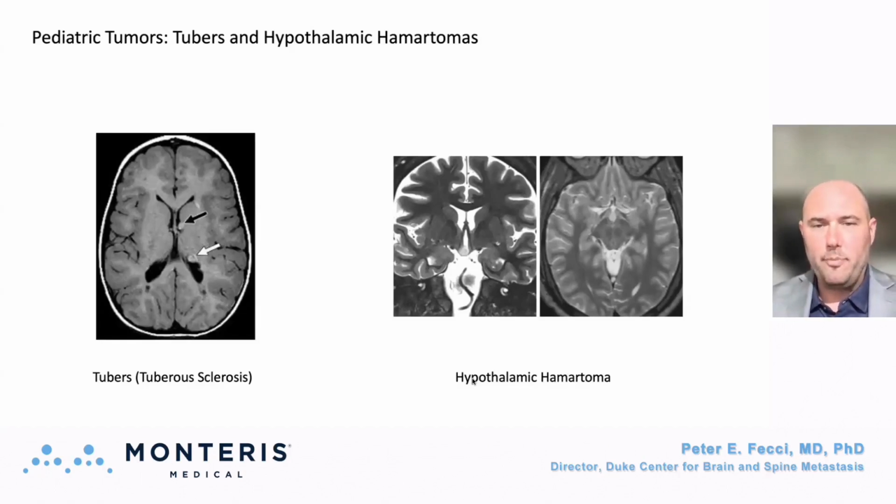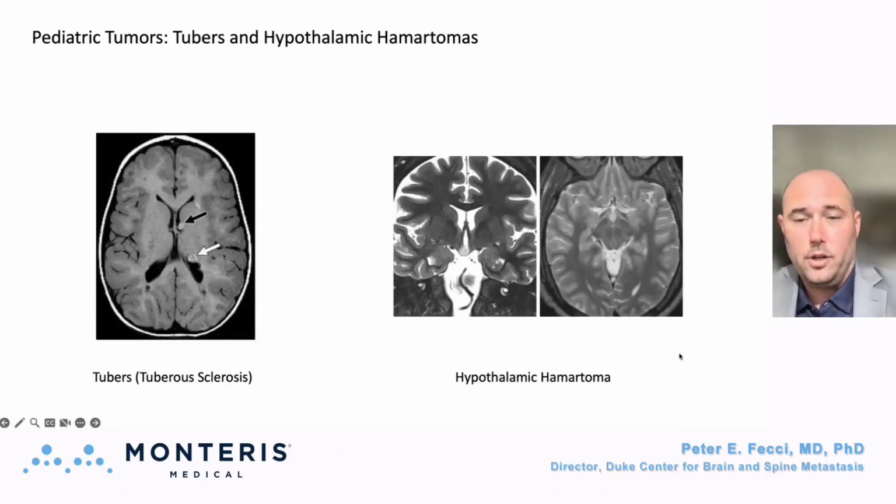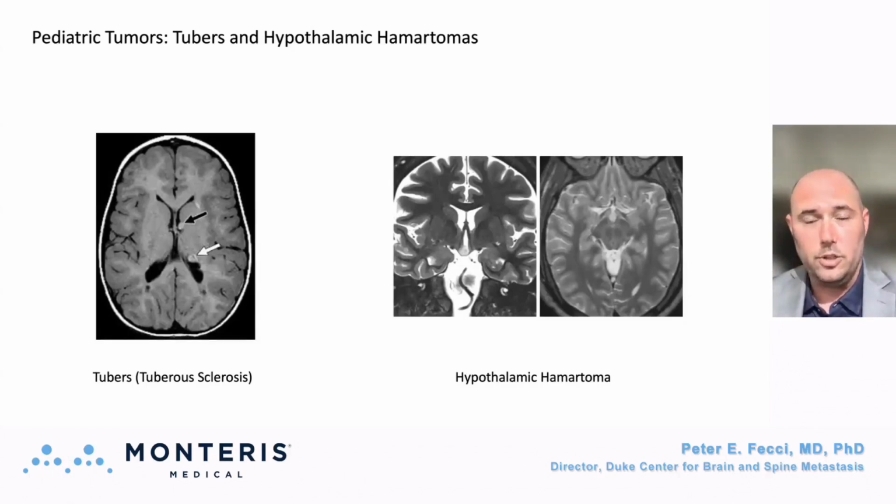And looking to the right, hypothalamic hamartomas. You can see the T2 bright lesion here, both in the coronal and the axial. I certainly have treated at least one young patient with gelastic seizures and a hypothalamic hamartoma. They left the hospital a few days later, now seizure-free after having had 8 to 9 seizures a day prior to that. This is a great use of the laser, deep-seated, difficult to access lesion, much less destructive, and can really reduce the seizure frequency in these kids, which can really be debilitating.